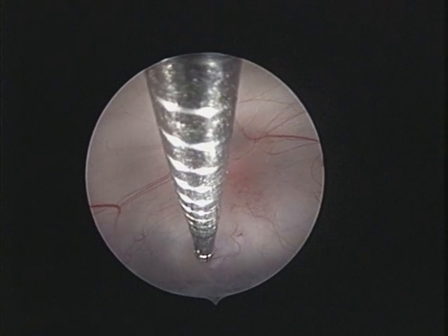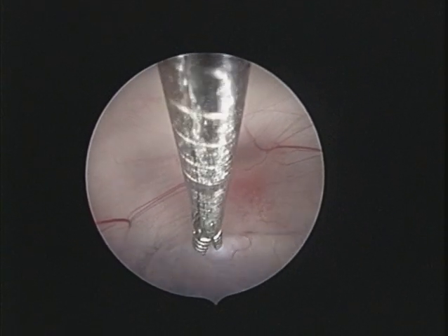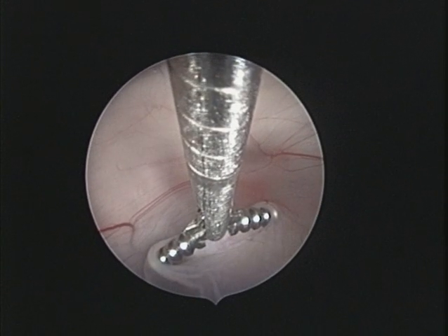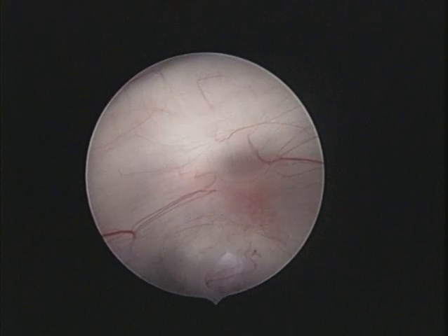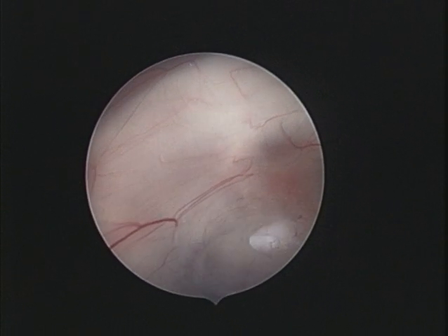It's in the premammillary recess that the endoscopic third ventriculostomy is performed using forceps. Note that the edges of the opening and the recess are pulsating immediately, which constitutes evidence of good flow of the cerebrospinal fluid between the cistern and the third ventricle.